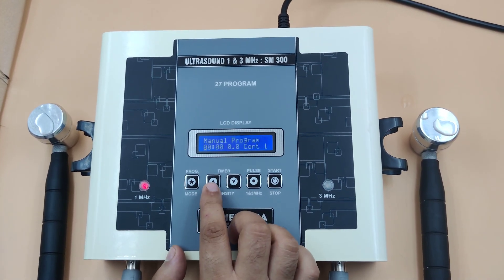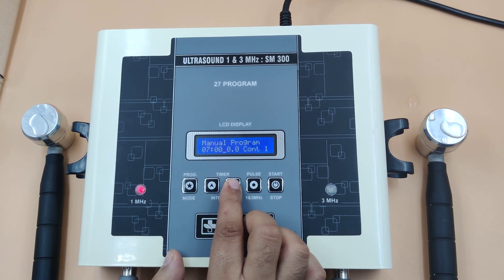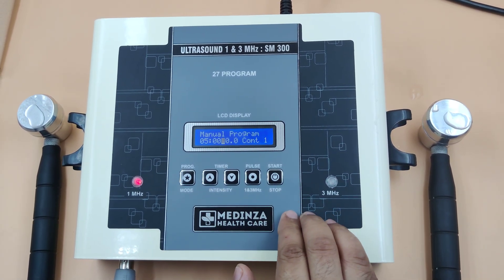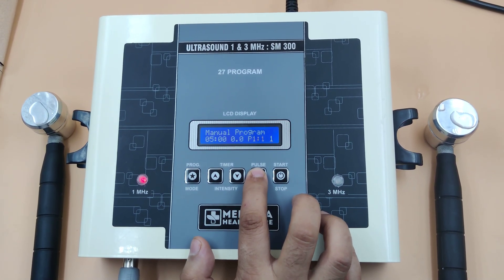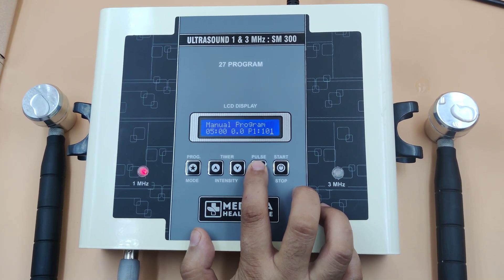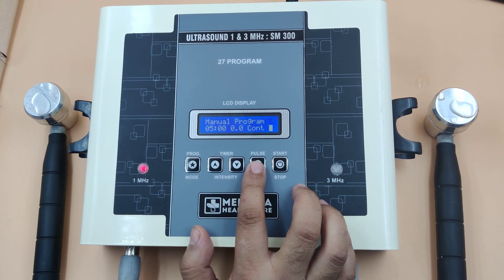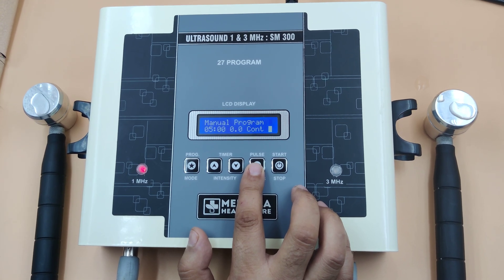Set the timer as per your need — use timer up or timer down. Now select the mode as per your need: continuous, pulse, and pulse ratio. In continuous mode, the maximum intensity is 3.5. In pulse mode, intensity depends upon the pulse ratio.